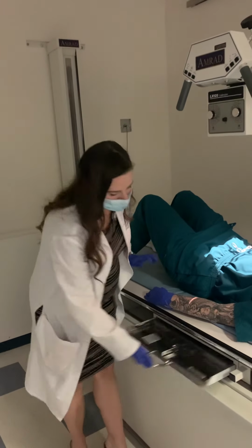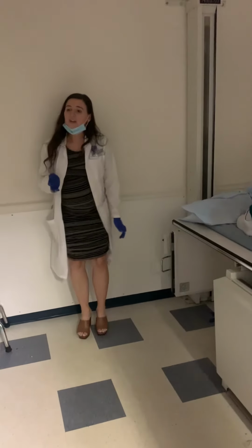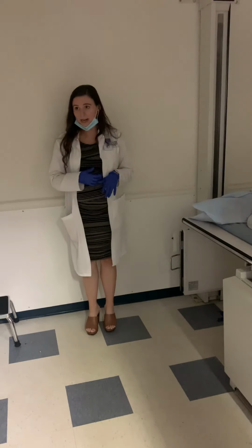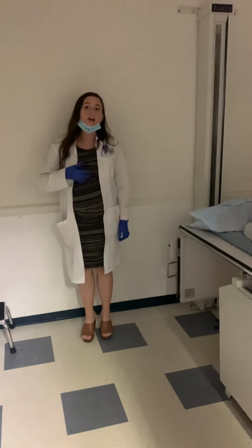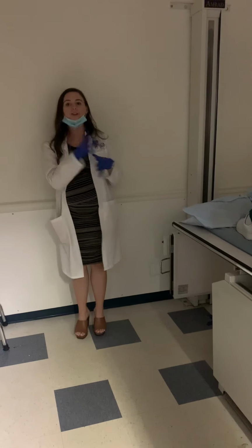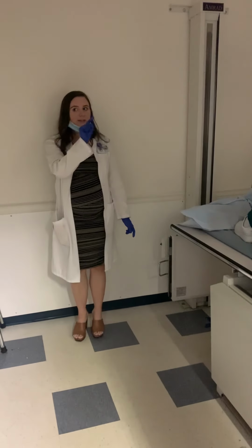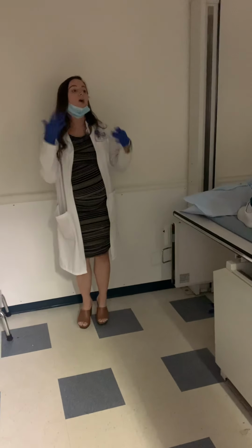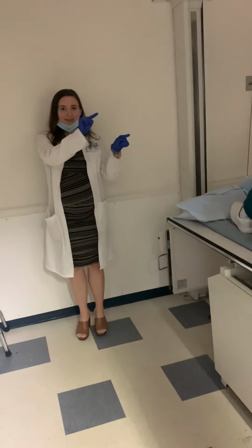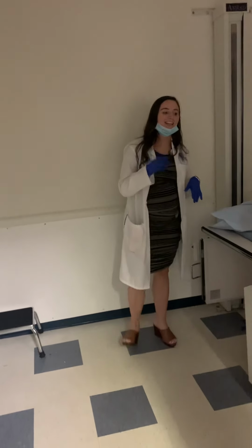All right, so first thing we're gonna do is the AP. And your center for this one, like I said, your Bontrager is gonna tell you about 3 or 4 different centers or CRs for this one, depending on the body habitus. Why? Because for this exam, we're looking at the stomach, and the stomach changes depending on your body habitus. If you're very tall and very thin or asthenic, your stomach is more of a J. And this is real. When you image these people, when you actually have contrast in the stomach, you'll be able to see it. If you're more average, it looks less like a J and almost more like a C. If you're wider or hypersthenic, your stomach goes horizontal. So instead of going like this, it goes more like this. That makes sense? Okay? So it changes depending on your body habitus. So that's why there's different CRs.